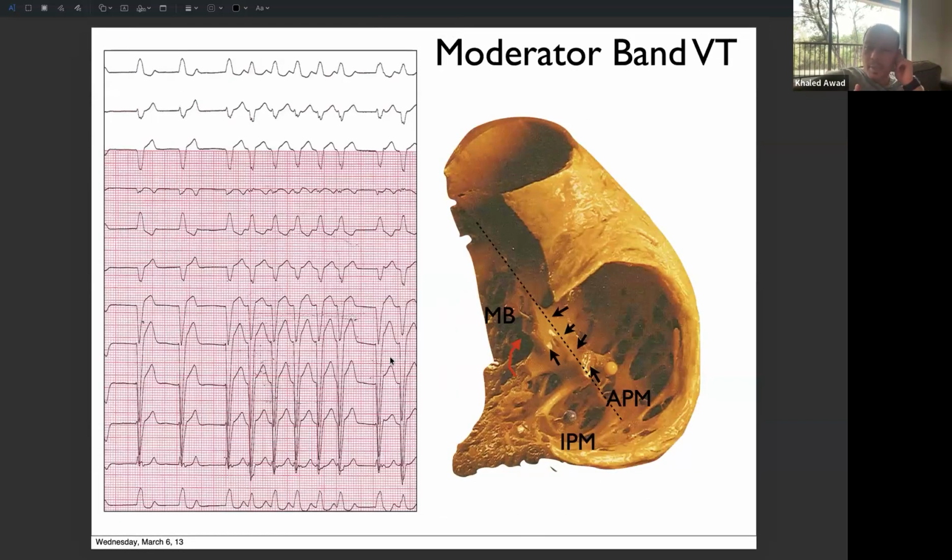Now, when you're in the right spot, what do you use? I usually use 40 watts of power, irrigated catheter, something like a Q dot or something of that nature. It's totally fine. You have to know your contact force. You have to always realize that you can cause a lot of damage in a normal heart. A normal muscle, you can actually ablate and perforate very easily, even in the ventricle. Remember what you're dropping with 40 watts. That's a lot of power.